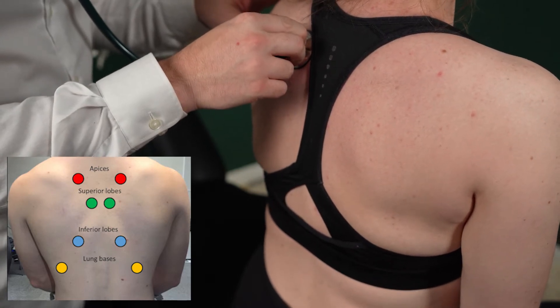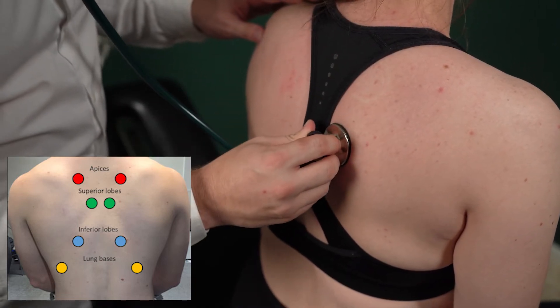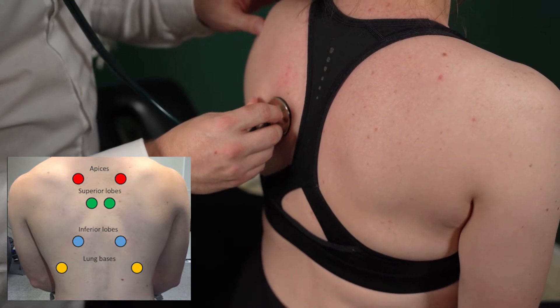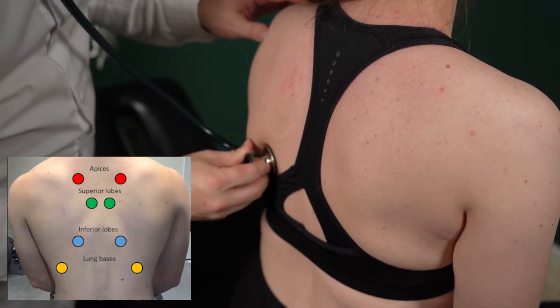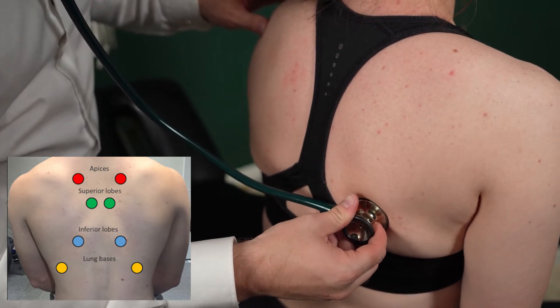The last part is the back. Placement here is very important — if you put your stethoscope over the scapula or shoulder blade, it'll muffle a lot of sounds. Go to the top medial part, closest to the spine, and place your stethoscope there for the first one. Tell the patient to relax, put their shoulders back, and take a deep breath. Listen on each side, then move down below the scapula and a little bit farther lateral, away from the spine, and listen again on both sides. Finally, move towards the tip, a little bit farther out — almost in that mid-clavicular line on the back. At the bases, the bottom two spots, you're listening for a sound almost like hair rubbing together — those are called rales, a fine crackling sound that indicates fluid or congestion at the base of the lungs.